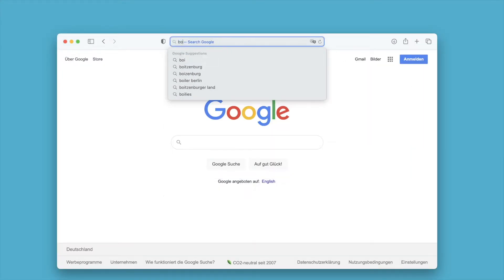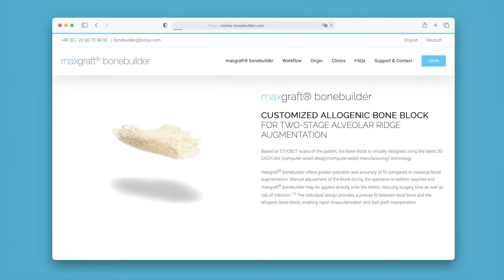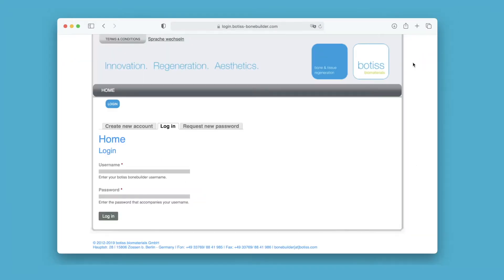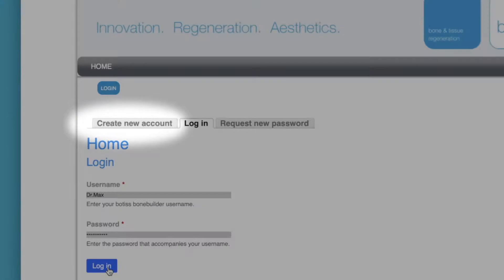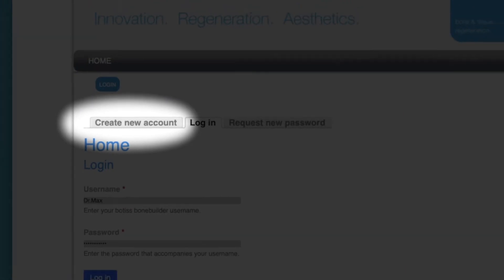Click on the login button on the website botiss-bonebuilder.com and enter your login credentials. If you do not have a user account yet, you can create a new account under create new account.